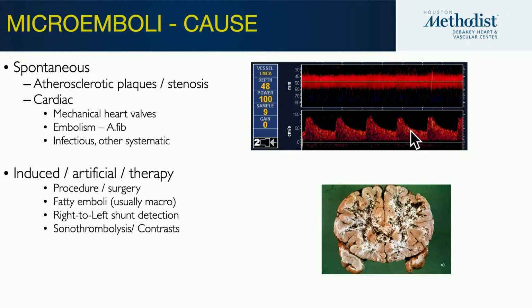So you see the aortic valve closure notch is there. This is why it's in the systole. And when it's in the systole, you can see it's traveling almost 80 centimeters per second, almost still inside that speed limit you want to drive on a highway. So translate your centimeters per second to miles per hour, but it's there.